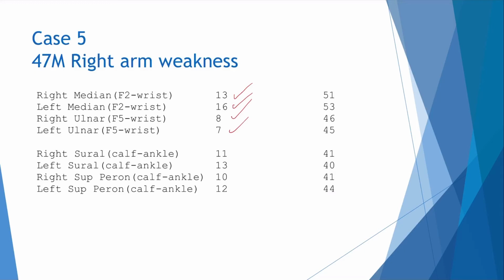Let's have a look at the feet over here, and again, this is just a warning sign really that there's been some extension of the study. If the patient's only been referred with one limb and you see more data going on elsewhere, you get a feeling that there's more going on over here, and all the sensory nerve responses are absolutely fine. So far the sensory responses are fine for upper and lower limbs bilaterally. We've now done a fair bit of motor studies here as well.